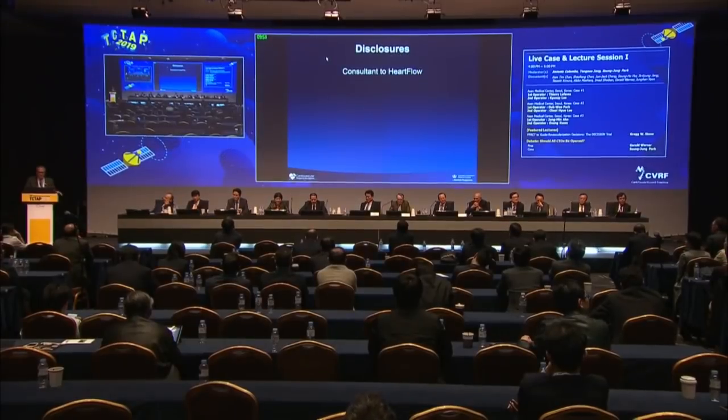All right. Gregg, our great friend, master of FFRCT to guide the revascularization decision, the decision trial, please. Great, well thank you, SJ.